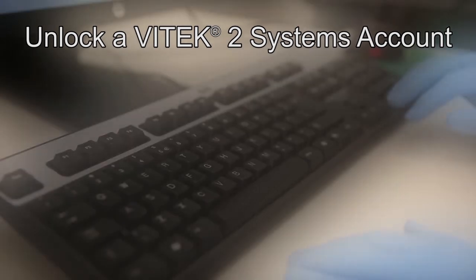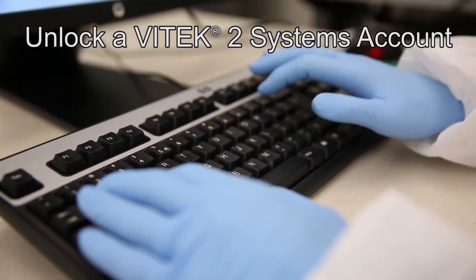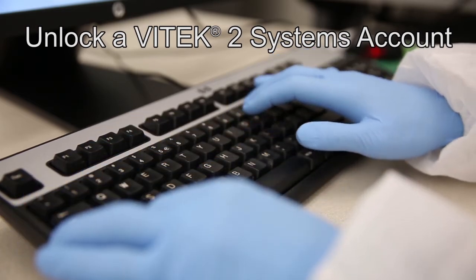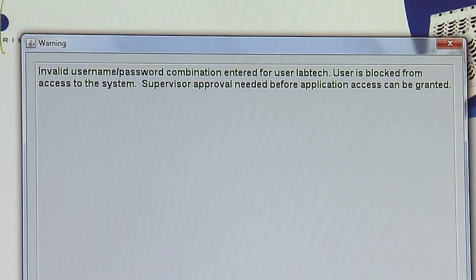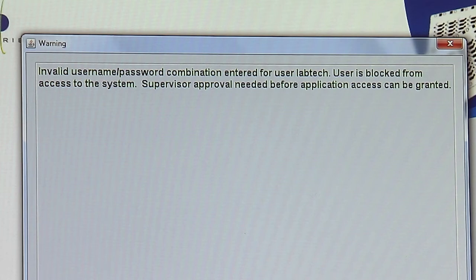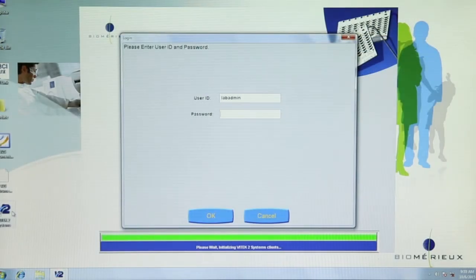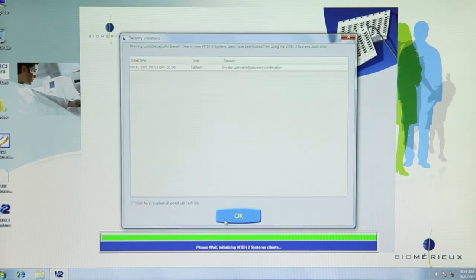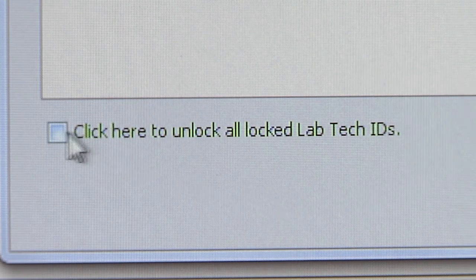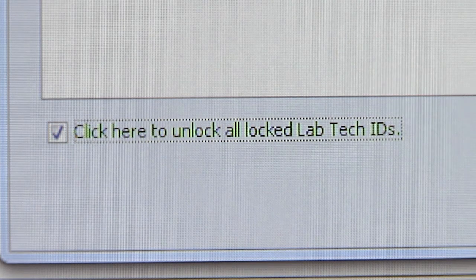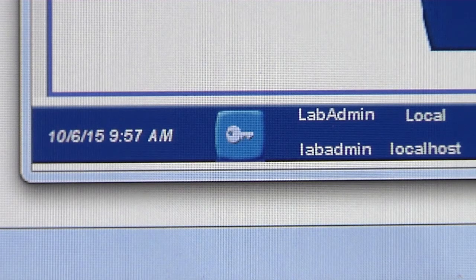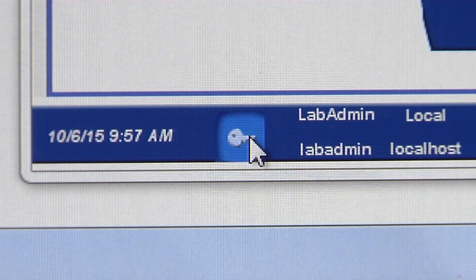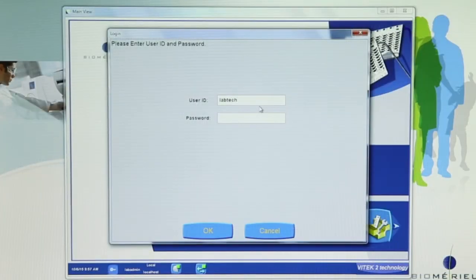Unlock a Vitek 2 systems account. Occasionally, users may lock themselves out of the Vitek 2 system software. The number of allowed login attempts is configurable — 2 to 8. If this is exceeded, a warning is given and the user becomes locked out. Note: it is not possible to lock out an account in the Windows 7 software. Log in to the Vitek 2 system software with a username and password with administrator or supervisor privileges. The security violation screen will display. Click in the box before the statement 'Click here to unlock all locked Labtech IDs.' Click OK. Log out of the Vitek 2 system software by clicking on the key icon and then Log Out. To verify access, have the previously locked out user log back into the Vitek 2 system software.